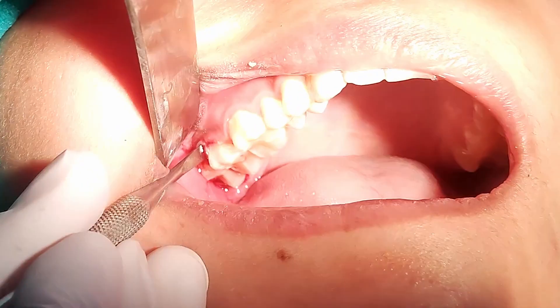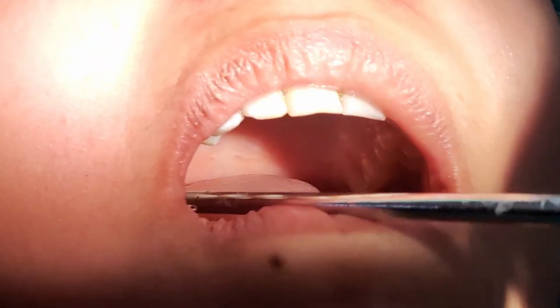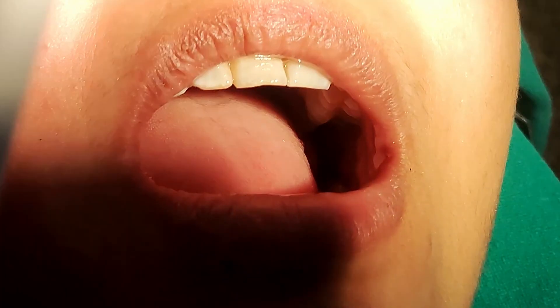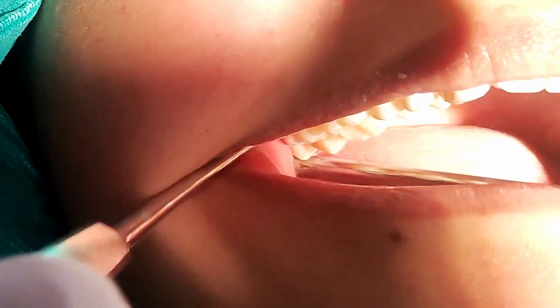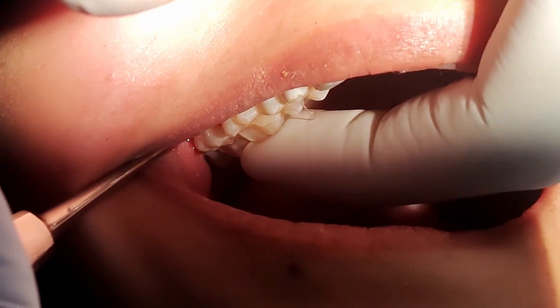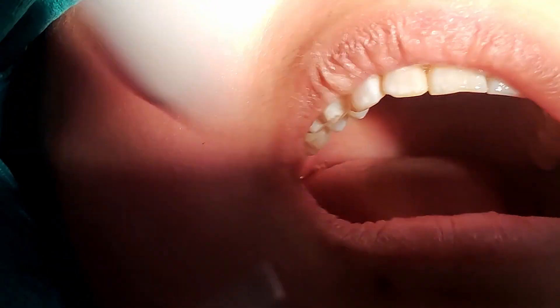Now with the periosteal elevator, I am checking if there is sufficient space between the second and third molar to place an elevator. Looks like there is enough space, so I am going to place my Warwick James straight elevator in this space. I am inserting my elevator between the two teeth with a flat surface towards the third molar. I will support the second molar with my finger firmly placed on its occlusal surface. Now I rotate the elevator so as to lift the third molar out of its socket. As the roots of the third molar are conical, it is easier to luxate the tooth.